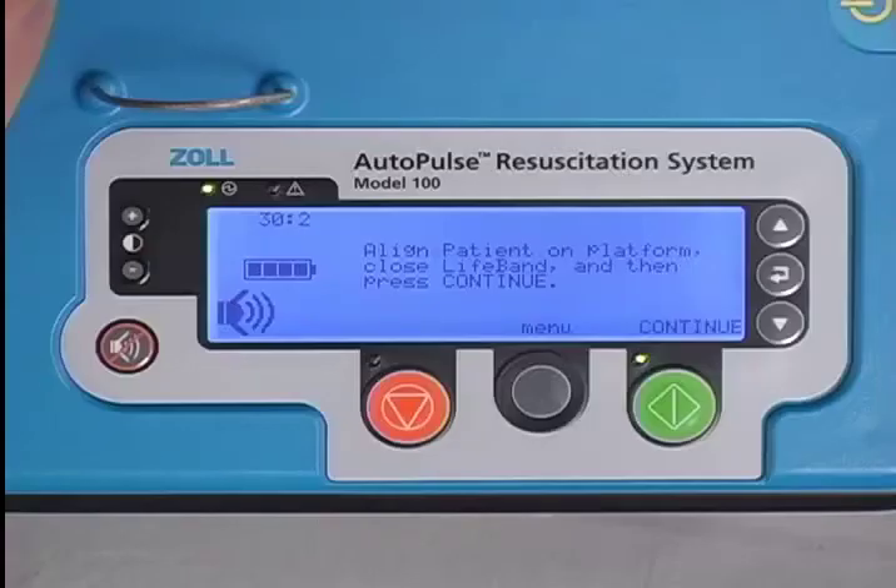Basic instructions are clearly laid out on the user display. It says: align the patient on the platform, close the life band, and then press Continue.